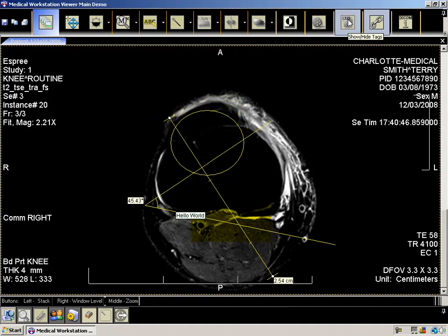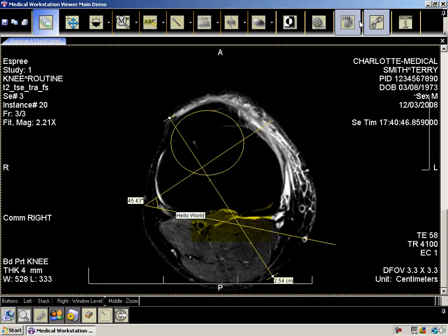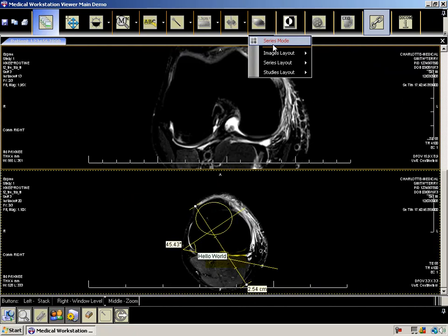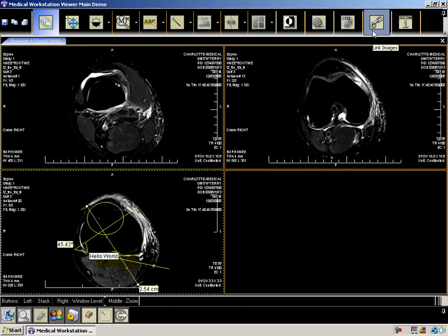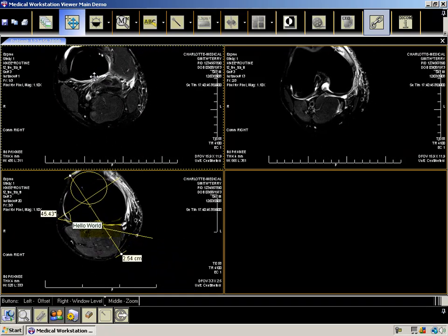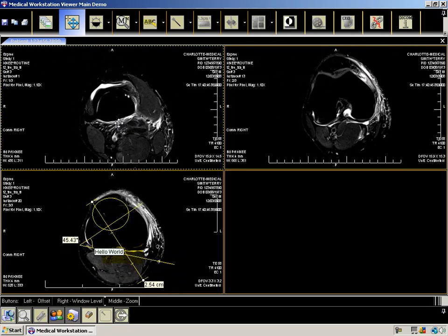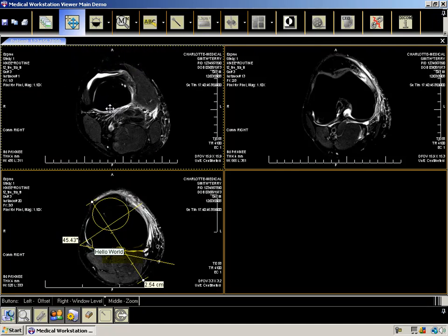You can enable or disable the display of the text around the image, also known as tags. The next button allows you to apply an adjustment to all images. Change to the series view and select the pan option to move an image. You'll note that with link images enabled, all the images move with the selected one. Unlink the images and move one again — the other images will no longer move.